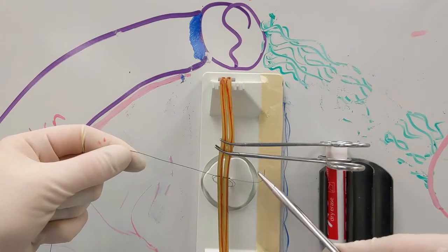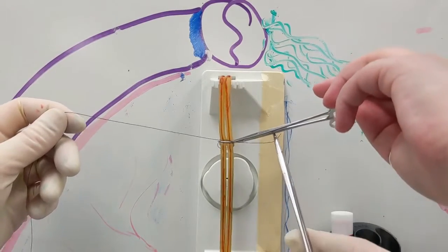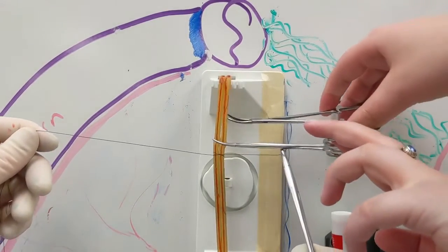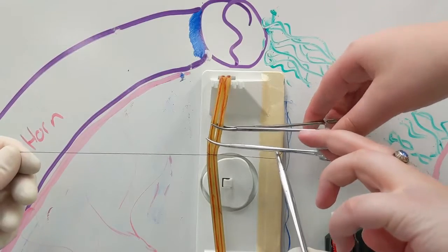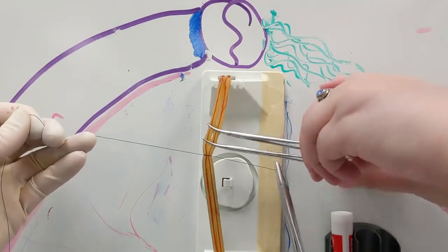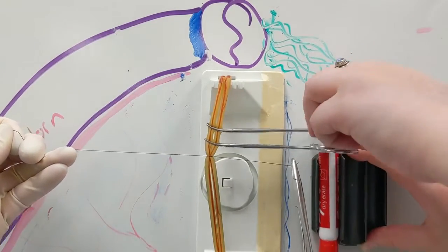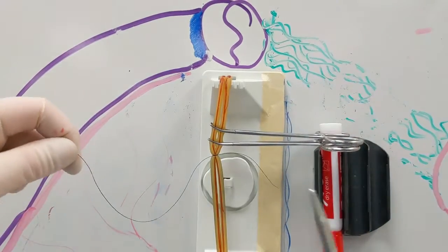And now because this is an ovarian pedicle model, we have our assistant remove that clamp so that we can place this into the crushed tissue. And our assistant replaces the clamp about five to 10 millimeters above the first one. So we'll keep steady tension on it for the first throw, and then as well in the second throw.